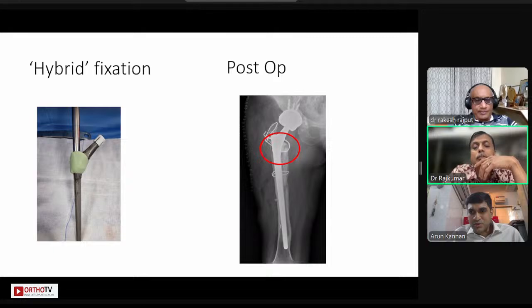So what is the thickness of the stem? The stem was 16 by 265, sir. A 265 stem, that almost goes so far down for her. It's not a 305 stem.